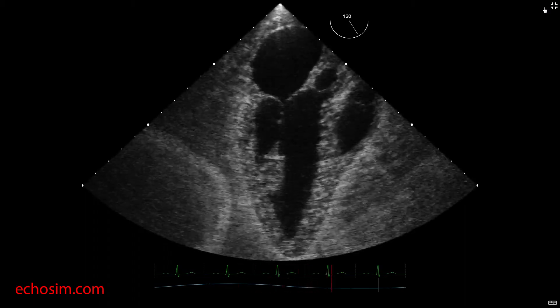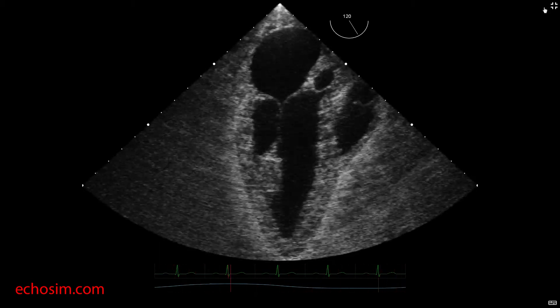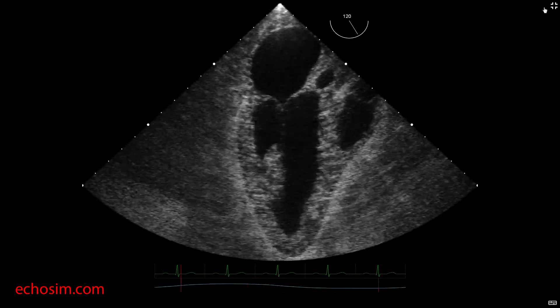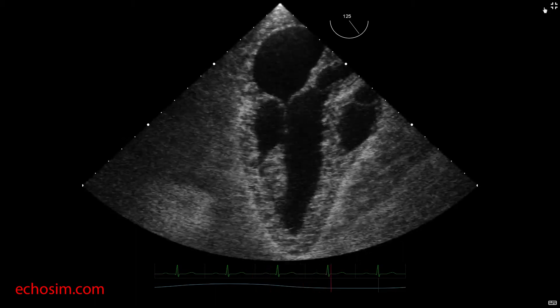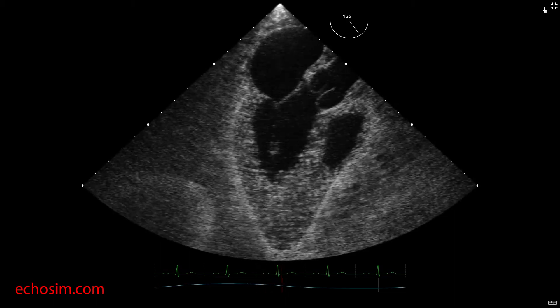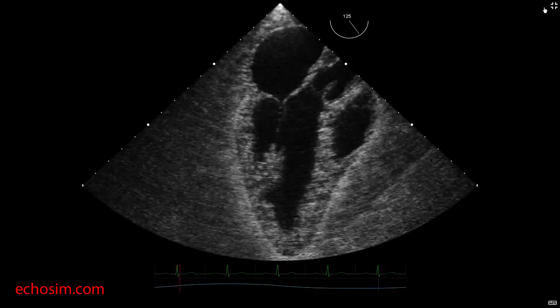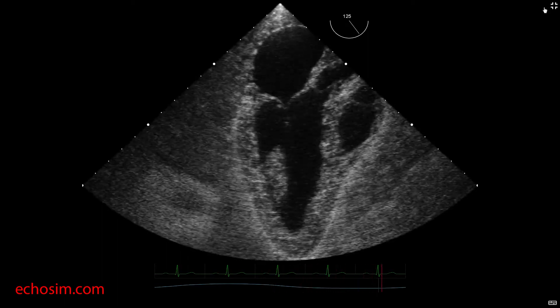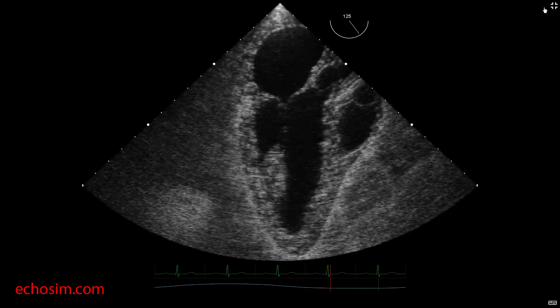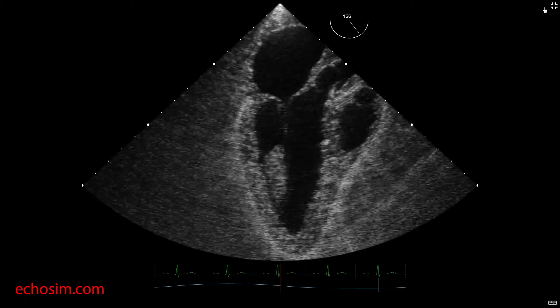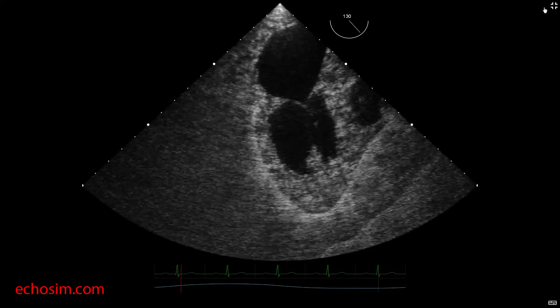The operator should shift attention to the aortic valve and ascending aorta. If the aortic valve and ascending aorta appear symmetric and fully displayed, then the view has been achieved. If not, an increment of approximately 5 degrees of omniplane should be added, and the entire procedure re-initiated starting with rotation of the probe to reveal maximized left ventricular area and a non-foreshortened apex. Holding all manipulations static, the aortic valve and ascending aorta should be re-evaluated. If not yet ideal, approximately 5 more degrees of omniplane can be added and the procedure repeated until the view is satisfactory with respect to the left ventricle, aortic valve, and aorta.